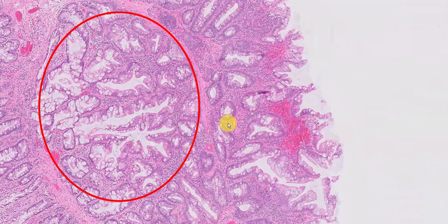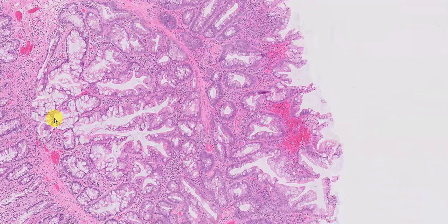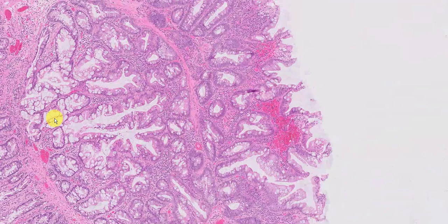So two questions arise. Is this enough to call this a sessile serrated polyp? When you have prolapse-like changes, particularly on the left side, you tend to see some dilatation in the basal regions of the crypts. In my book, this does not qualify for a sessile serrated polyp, but I bet my bottom dollar that there will not be a hundred percent agreement on this.